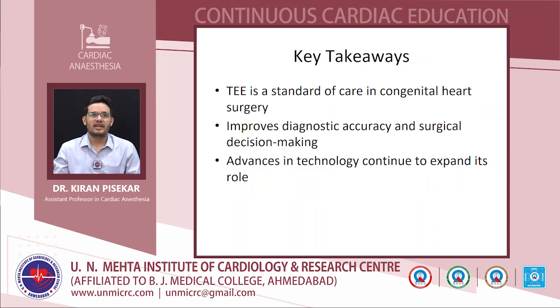So now the key takeaway: TEE is a standard of care in congenital heart surgeries. It improves diagnostic accuracy and surgical decision making, and advances in technology continue to expand its role. So we have seen that 3D imaging gives us more valuable information than 2D, but again it complements. 2D remains the standard of care, and 3D complements the 2D imaging.